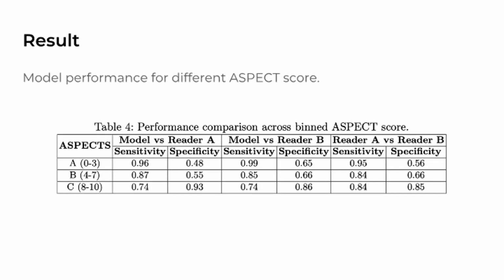Due to the subjective nature of ASPECTS, we have seen that even though the sensitivity of our model is very high, it has very low specificity. Therefore, it is best to judge the performance of the model based on binned ASPECTS as shown in the table. The score was binned based on the treatment outcome given the score.